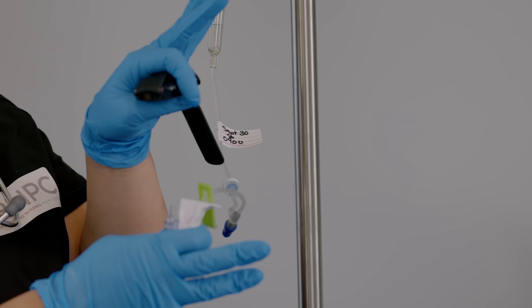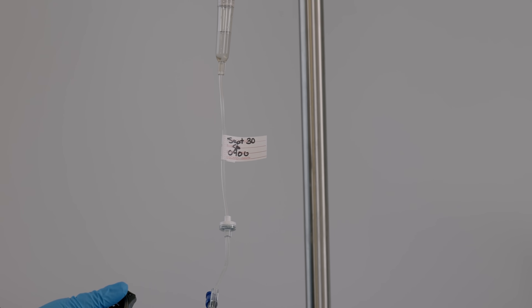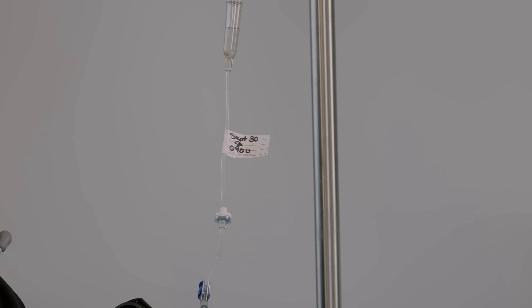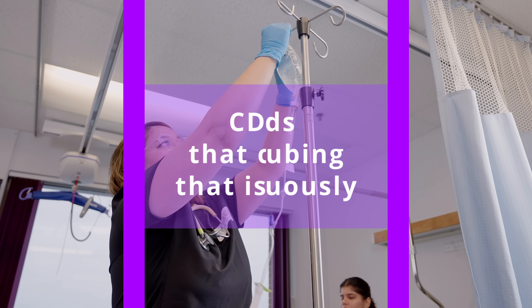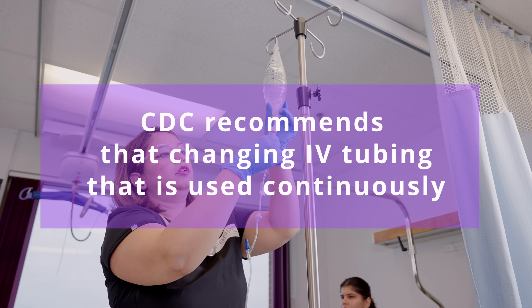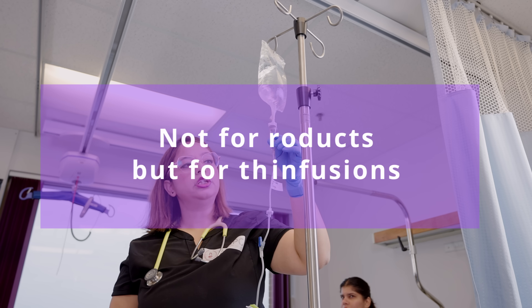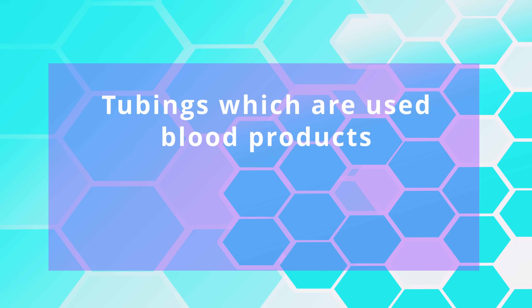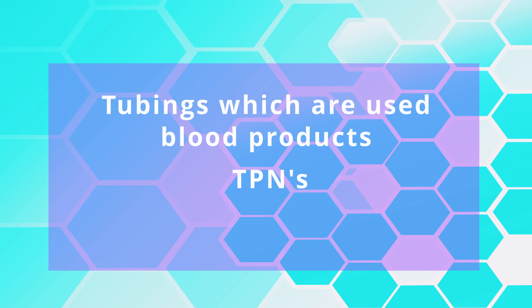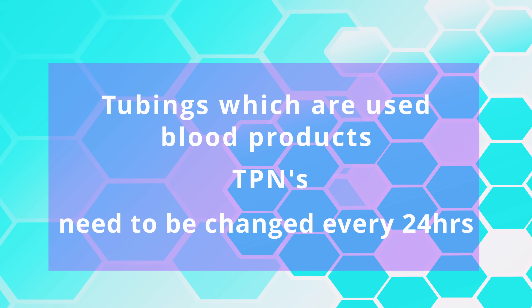Always remember to label your tubings with date and time because tubings also expire, and we have to follow hospital protocol or guidelines to change them. CDC recommends that IV tubing used continuously for simple IV infusions — not blood products — must be changed minimum every 96 hours. Tubing used for blood products, TPNs, and fat emulsions needs to be changed every 24 hours. However, please follow your agency policy.